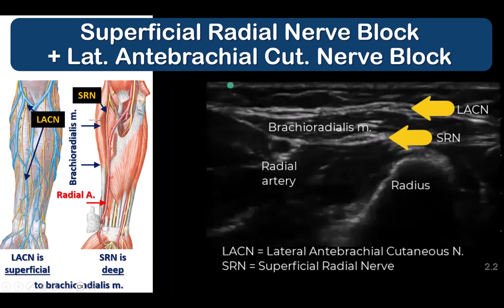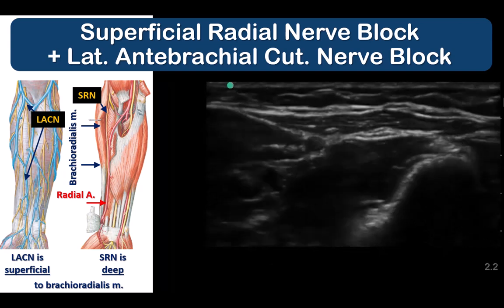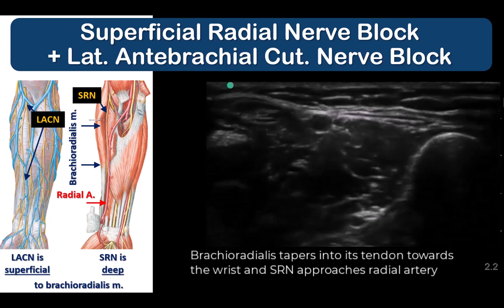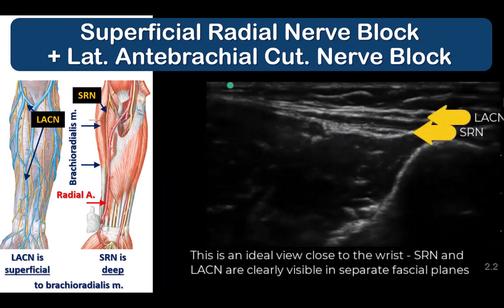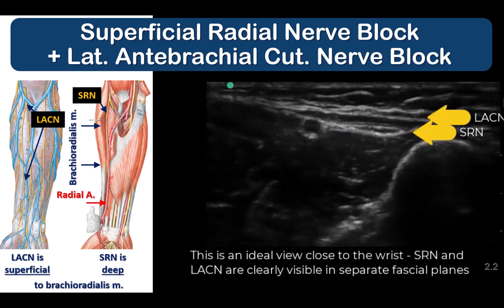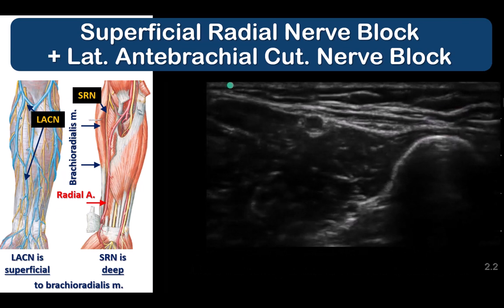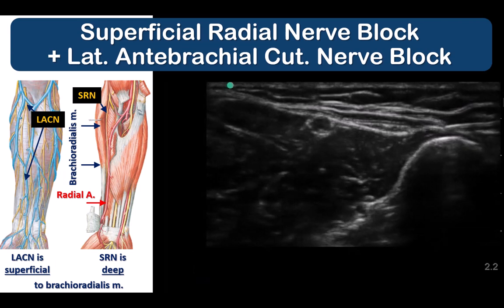In this second example, we start by looking for the radial artery in the distal third of the forearm under brachioradialis. Tracing distally usually reveals the superficial radial nerve and LACN sliding along the deep and superficial surfaces of the muscle respectively. The radial artery and superficial radial nerve are deep to the brachioradialis muscle, while the LACN lies superficial to the investing fascia of the muscle. Both can be identified by tracing proximally and distally along the muscle.